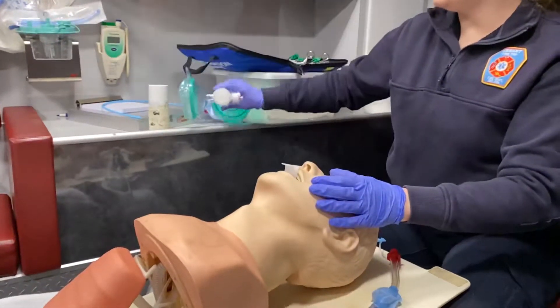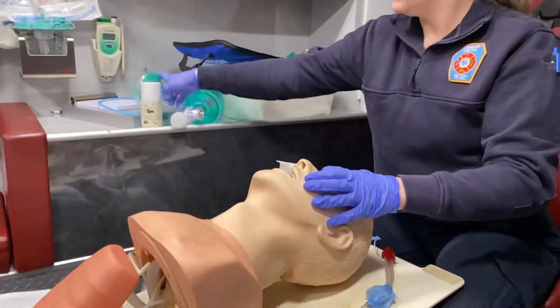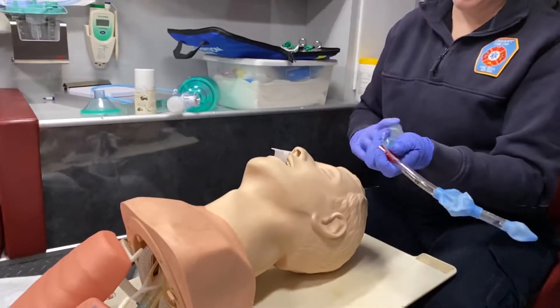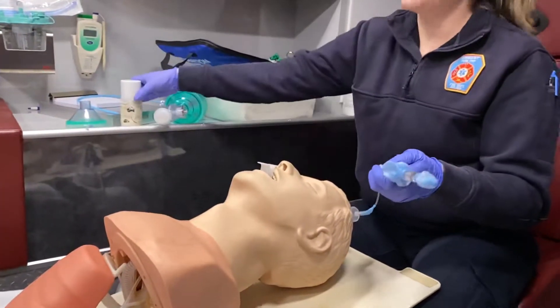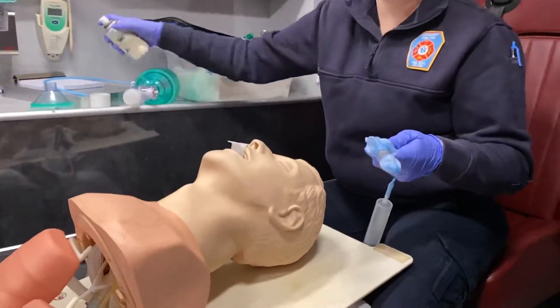I'm going to look at my equipment and pass off my BVM to my partner. We want to pull out and make sure we have the right King Airway, confirm our balloon is patent and there are no leaks, make sure our syringe can attach, and we do want to lube the distal tip of this device so it goes in easier.